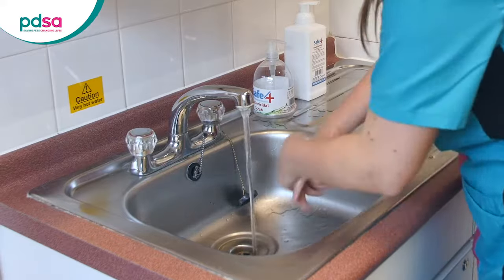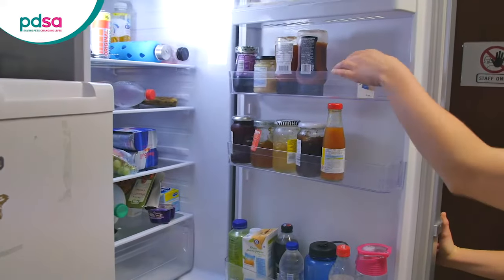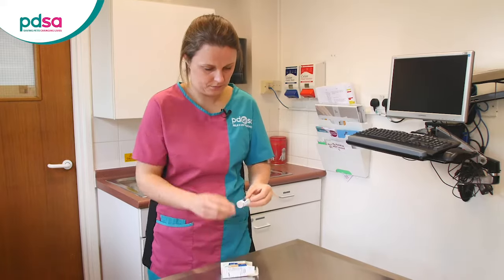First, wash your hands. Collect your dog's insulin from the fridge and gently rock the bottle a few times.